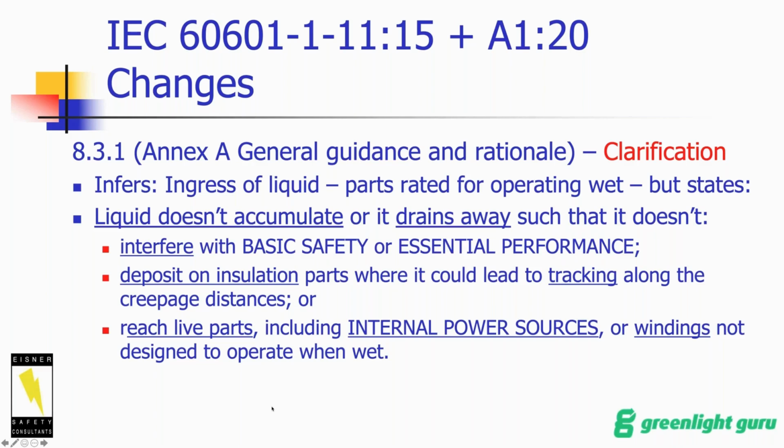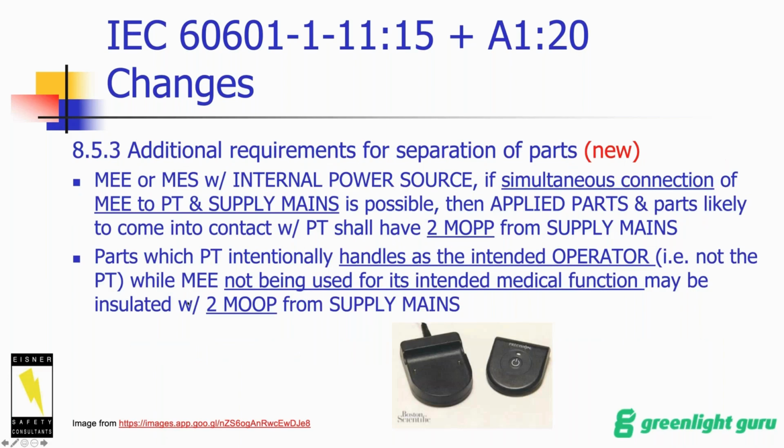Basically, to me, this comes down to IEC 60529, ingress protection testing; the updated version of that standard basically says a lot of this, just not quite in these terms. I've had a couple of clients that have argued with labs, some successfully, some not so successfully. So now I think it's much clearer in the back of the standard. This is an important clarification; even though these are minor changes from what everyone's saying, this is not so minor to be aware of. So this one is very clear, cut and dry.